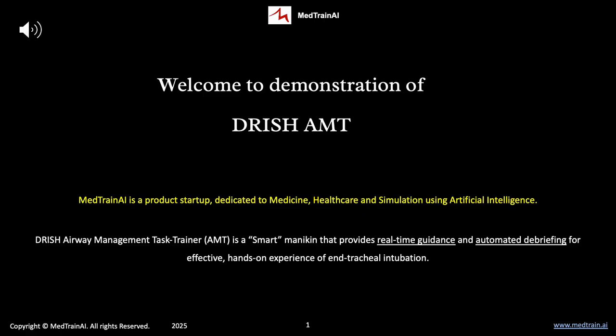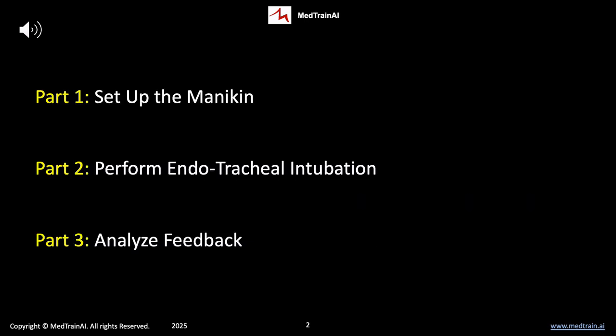The Drish AMT is a smart mannequin. It provides real-time guidance and automated debriefing for effective hands-on experience of endotracheal intubation.